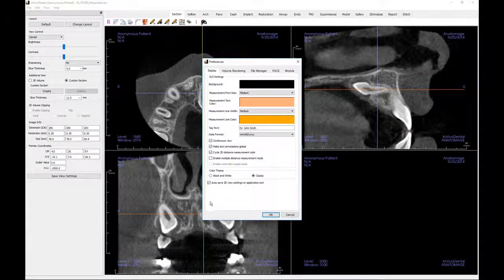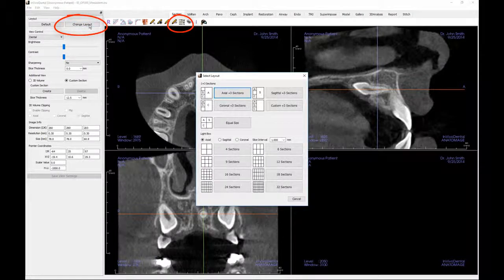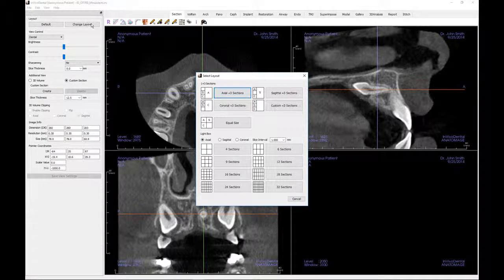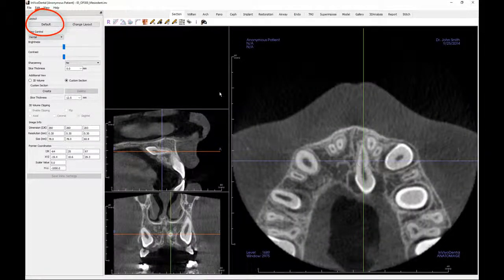The screen layout may be changed by selecting either Change Layout in the control panel or by clicking the icon on the toolbar. The default setting is equal size for the view windows. There are four additional view windows available, such as Axial plus three sections, which will make the axial view more prominent than the other two. To revert to the default view, click on Default in the Layout section of the control panel.